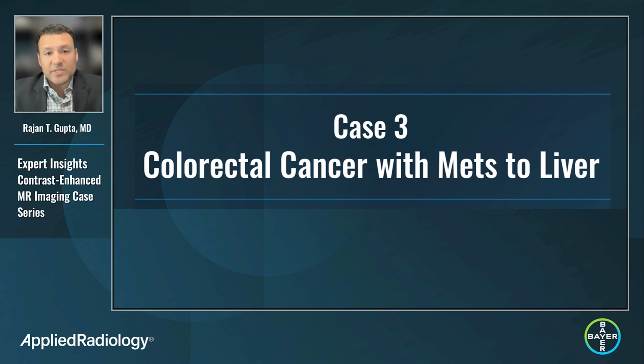One of the treatment options that we have available for some of these patients is hepatic arterial infusion pumps. And hepatic arterial infusion pumps require a few different things. Obviously, a surgeon who's going to be putting those pumps in, and then a comprehensive evaluation of the liver that gives an understanding of the arterial supply to the liver, the arterial anatomy of the liver, as well as the volume and distribution of metastatic disease through the liver.